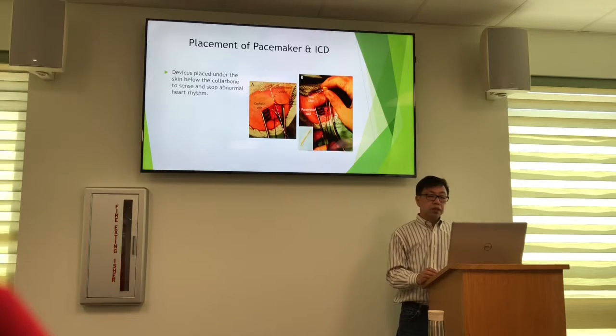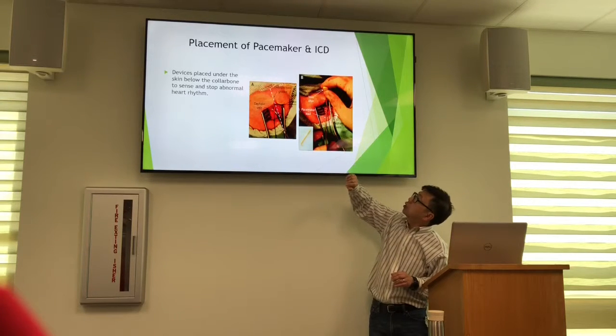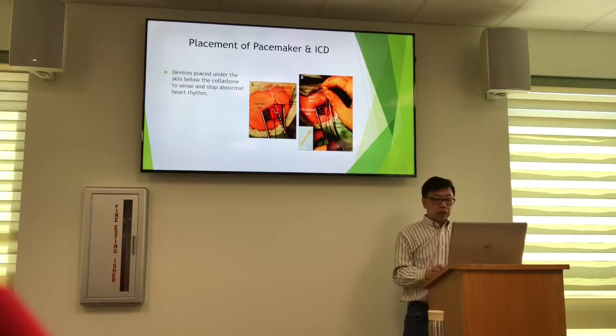Placement of a pacemaker or an ICD. As you can see, there's a pocket open on this patient. The incision for this pocket will mostly be on the left side below the collarbone. Once the pocket is formed, we'll obtain transvenous access to the right heart chamber through the subclavian vein or cephalic vein. There are a few techniques for vein access. This particular one is a cut-down procedure.